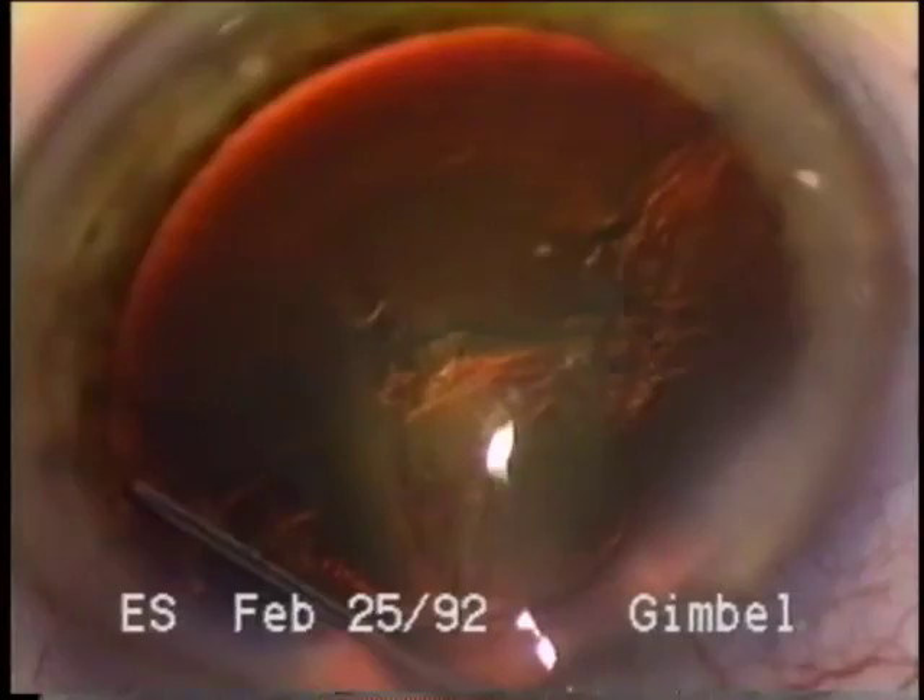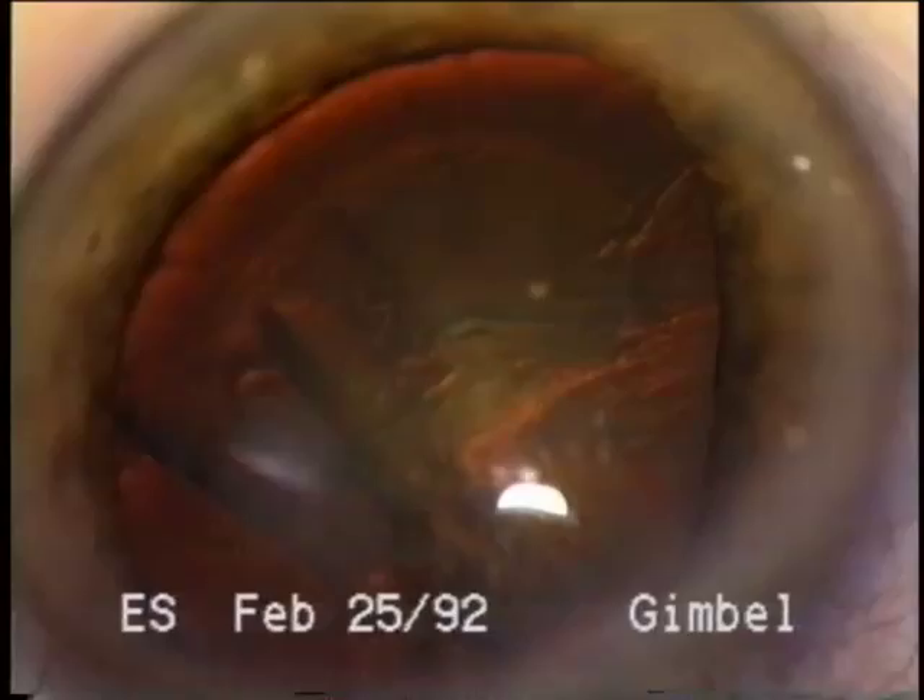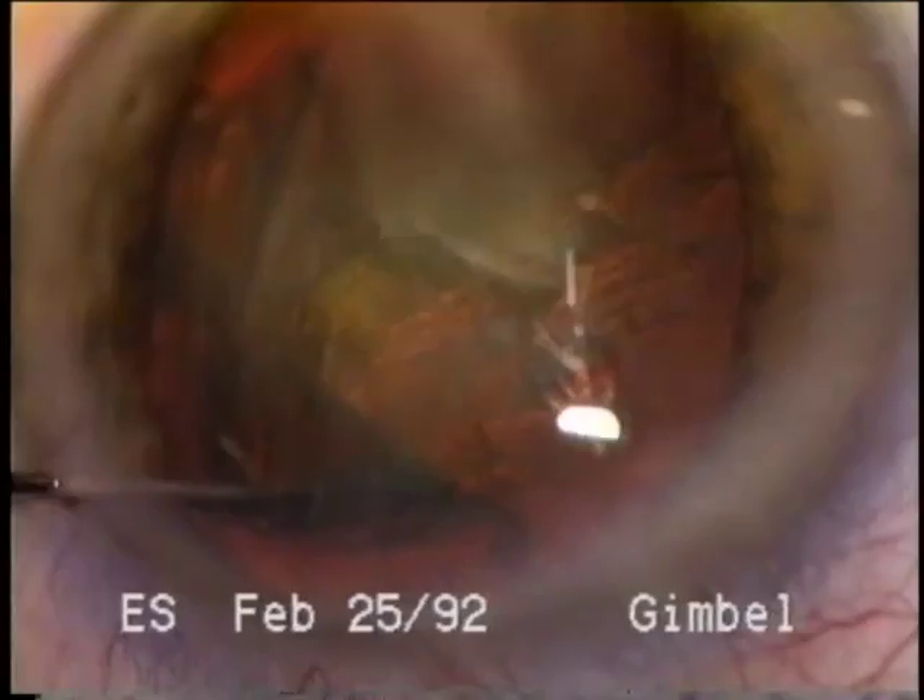Hydrodissection has been established as a useful and advantageous technique employed by most surgeons in nearly every case. Following a successful continuous curvilinear capsulorrhexis opening, I accomplish hydrodissection just under the anterior capsule using a 30-gauge cannula on a 3cc syringe. This fluid injection will normally cause the lens to herniate forward. Completeness of the hydrodissection is verified by easy rotation of the nucleus within the capsular bag using the 30-gauge cannula.